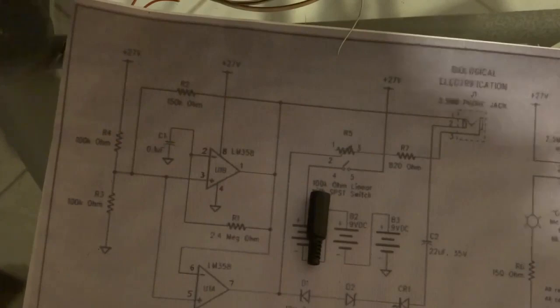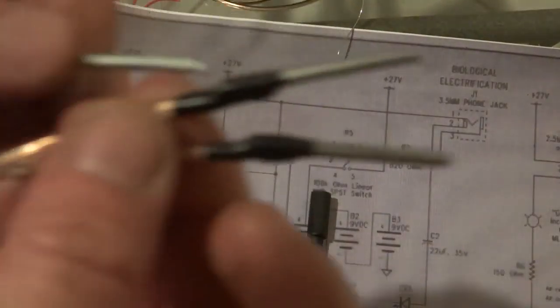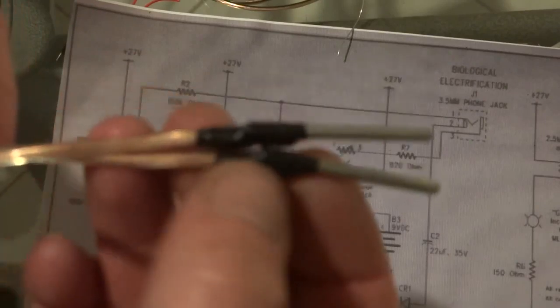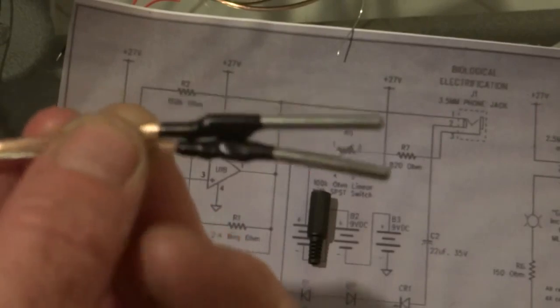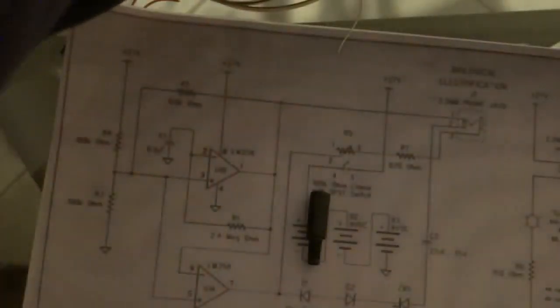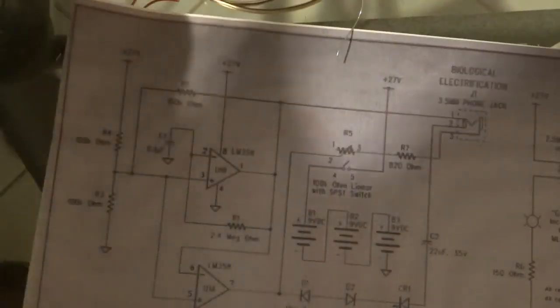Get two stainless steel pins, solder them onto the wire, and tape them up like that — tape them onto the wire.